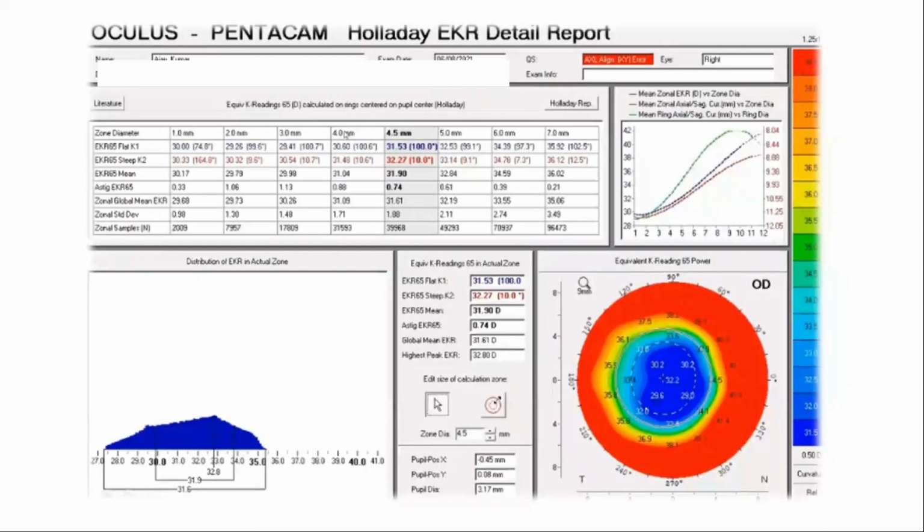One more question. What Dr. Tulsi just explained, does that not give too much overlap with the EyeTrace findings, especially while planning for a cataract surgery? There is quite some overlap. So maybe we are underutilizing this, and trying to find those loopholes through EyeTrace which might be fulfilled through Pentacam alone.